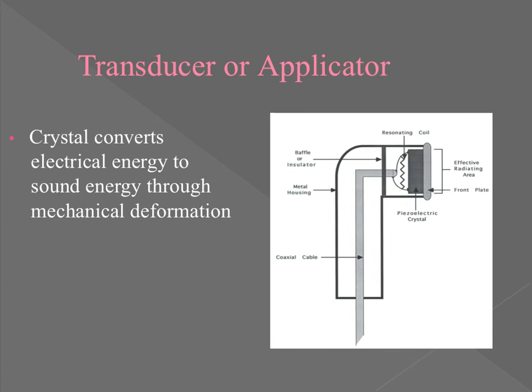So as we progress, why is that crystal hugely important? What we know about the crystal is the key to ultrasound. The crystal is what converts that electrical energy to sound energy, right? This crystal within the ultrasound head is capable of flattening and then widening and then flattening and then widening.